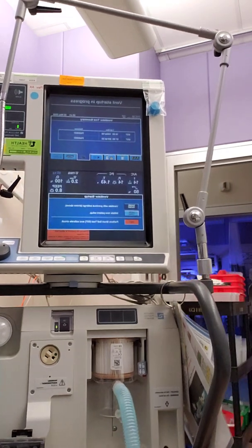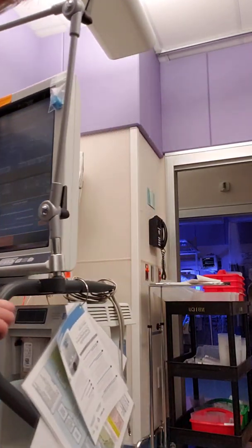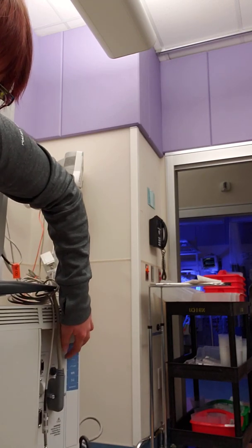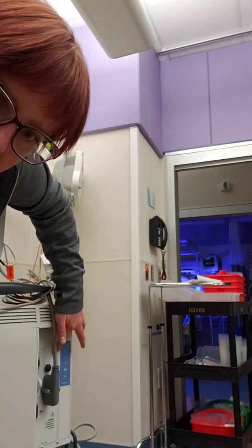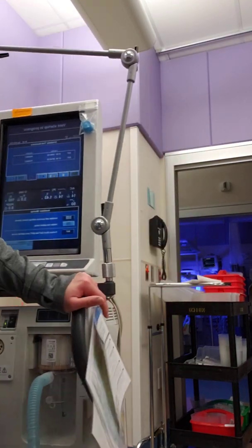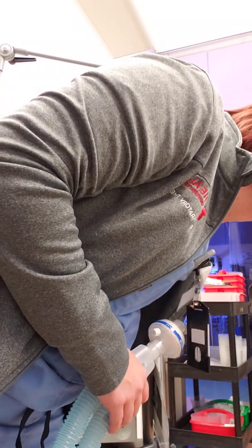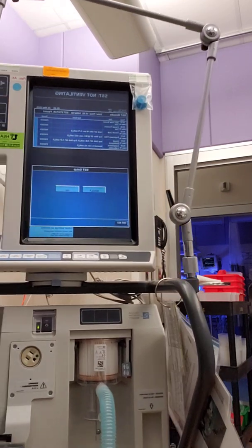Oh, sorry, it's been a minute since I've SST'd one of these. With SST, you have just a couple, 5 seconds, and you will press this button on the side here that says test. Oh gosh, I'm so sorry, you guys cannot see that. Over here, it says test. So when it says the test button, this little black one, you have to press it within 5 seconds in order to run an SST. So, and then I'll press the test button. Next, we will come up to this screen.